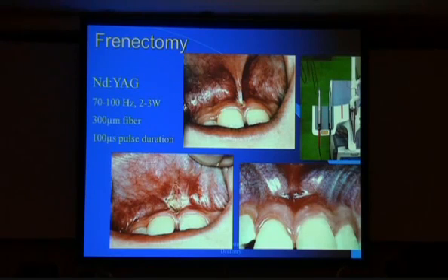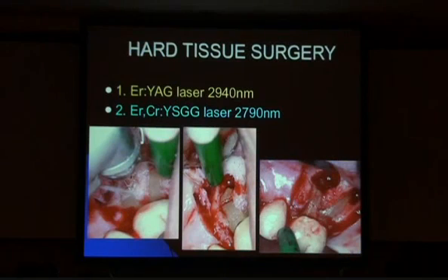And if we know how this treatment has to be done for an oral surgeon, I think among you here there are oral surgeons, it is not a task of 3 to 4 minutes, at least if you are very fast, 10 to 15 minutes. And you have a bleeding, and then you have to be experienced as well. And if you know the technology, the technique of using a laser, you can get very nice results.